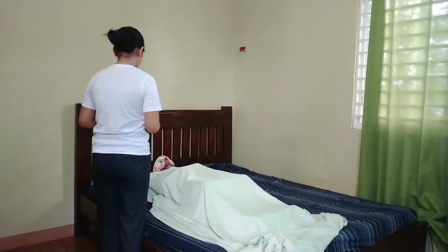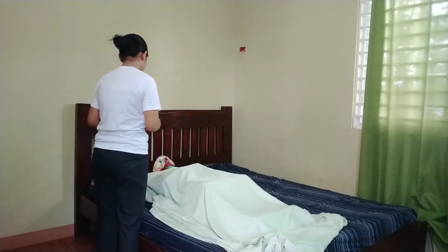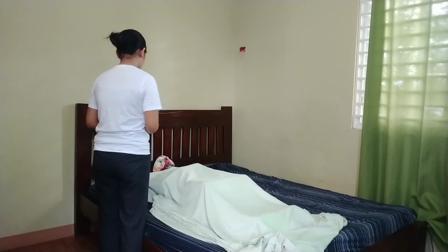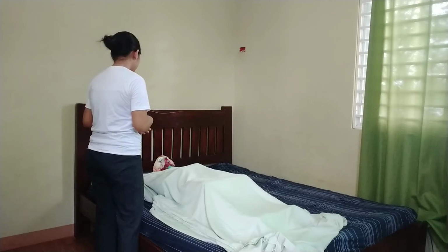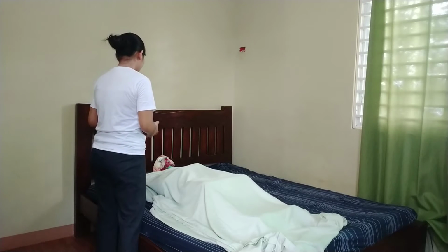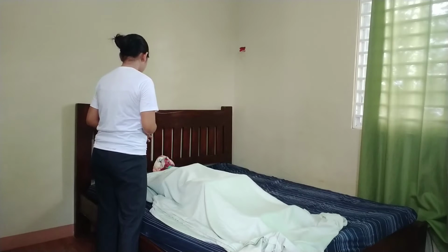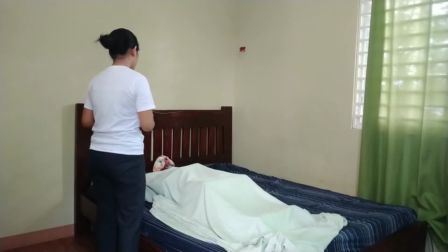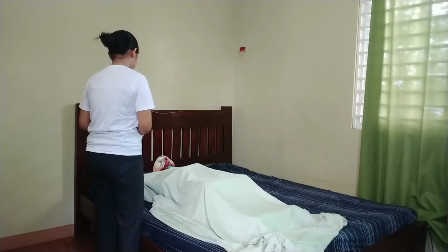Okay, let me just confirm again. You already signed a written consent prior to this procedure, right? Okay, thank you, ma'am. So during the procedure, I want you to lie still. Do not change position or touch the heat lamp during the procedure, and notify me if you're feeling any discomfort, burning reaction, or untoward reactions.